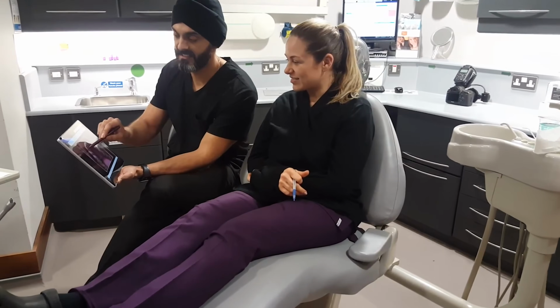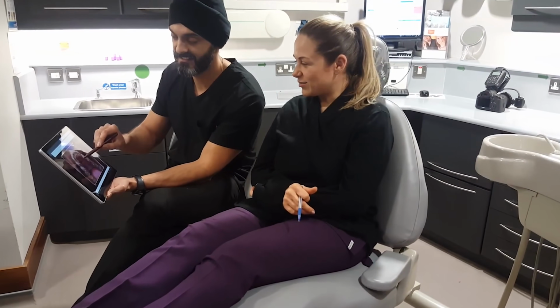Let's assume that we've had a consultation, myself and the patient, and a detailed conversation, typically about 2 hours. We've explored all of the options. We've taken a basic level x-ray, which shows me where bone is, and whether we need to look at more complicated zygomatic implants, or are okay with standard implants, which we're okay with in today's case.